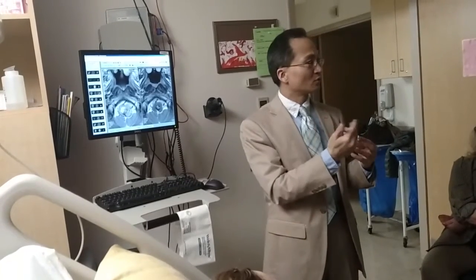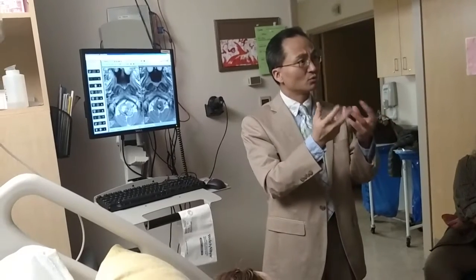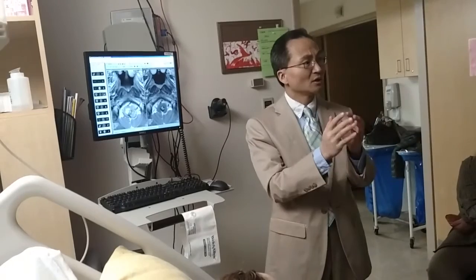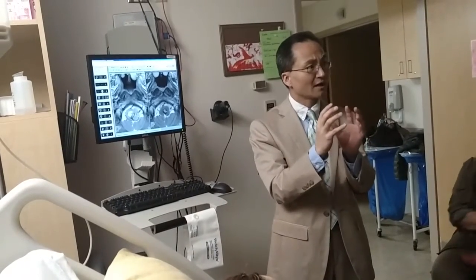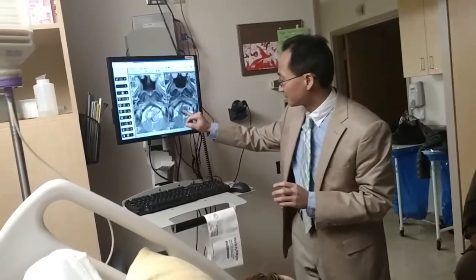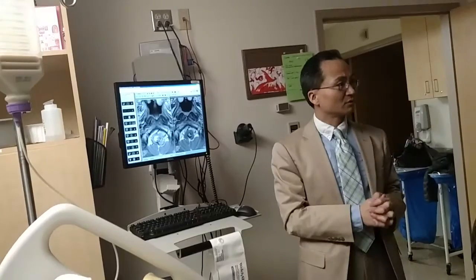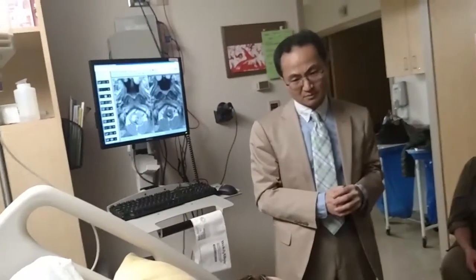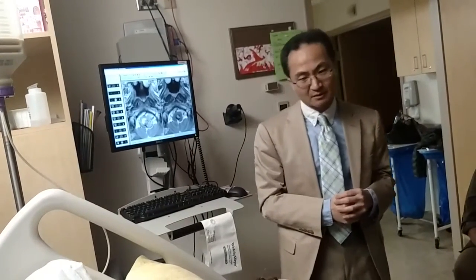But now it's more liquidy. So we're hoping once we split, the fluid will ooze out, and it has done a dissection for us. And then we have a relatively more clean margin on this cavernoma, which is this thing. And then it can deliver itself out with much less trauma. That thing looks like a small blueberry. We'll get that out too, right? Yeah, that's coming out.